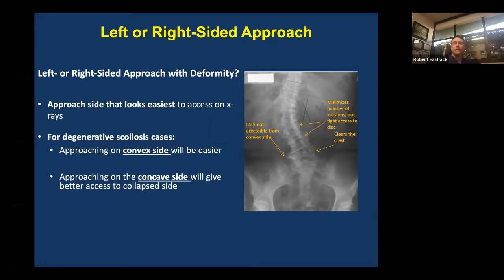Here's a look at a scoliosis case where the approach is obligated to the right side of the screen. You can be working over the crest and you're going to work in the concavity of the curve. You're not going to be able to get to L4-5 from the convex side of the primary curve.